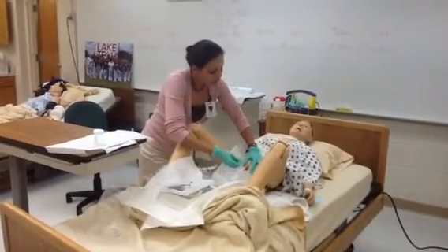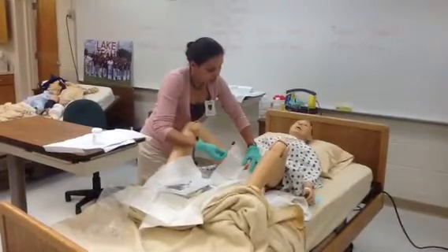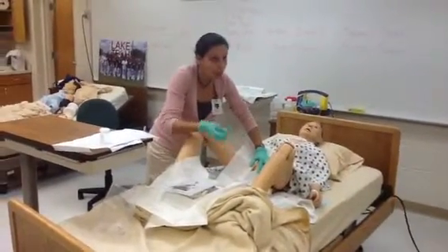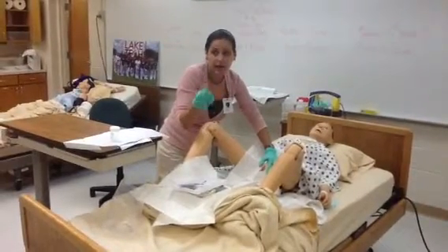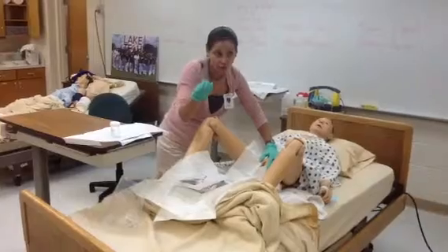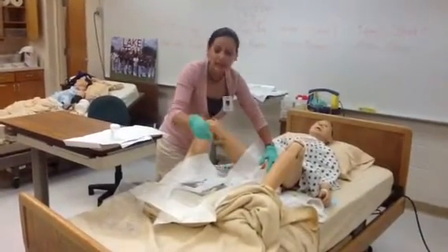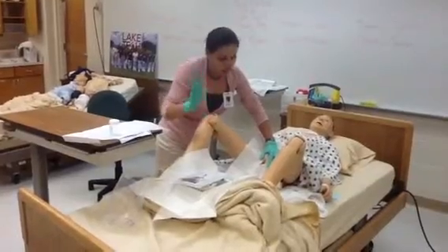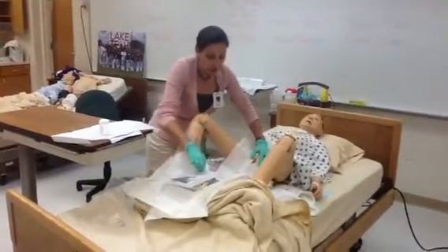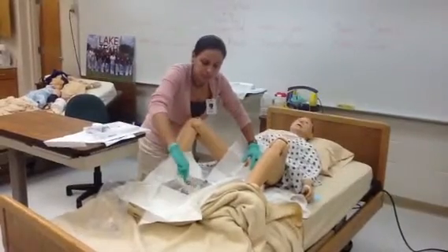And with this one, you need to keep your eyes trained right on that vaginal canal because you're hoping to see this iodine pool up and cause a little bit of a sphincter reaction, a wink of the urethra. So you're looking for the urethra to wink at you. And you don't want to take your eyes off of it. You want to try to have mastered that. You can move this piece here.